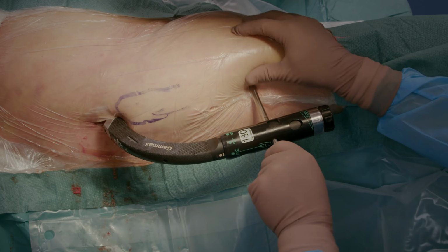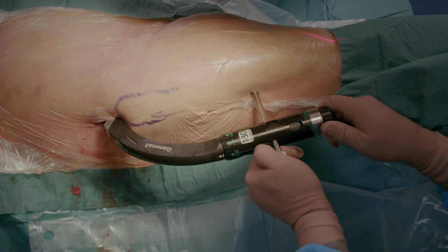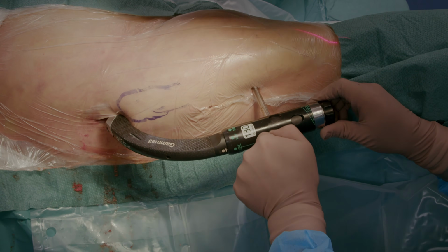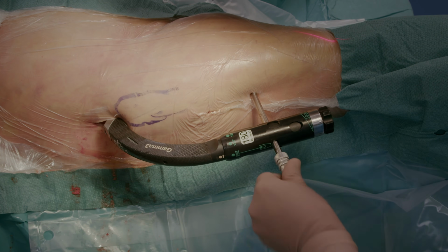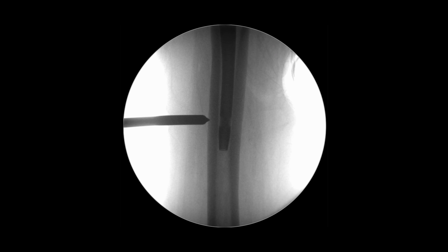We place this locking screw guide sleeve with the trocar against the bone surface. We can check by fluoroscopy that it's in place and tighten it in place from the black knob of the speed lock sleeve.